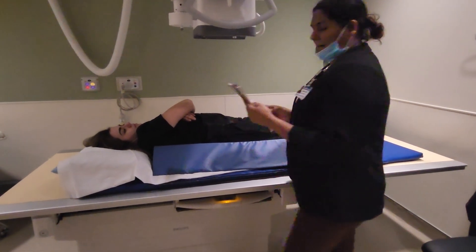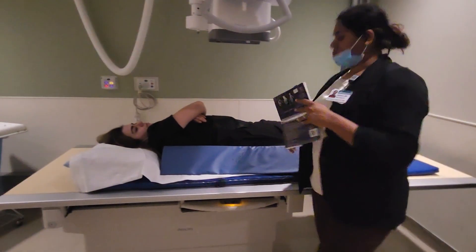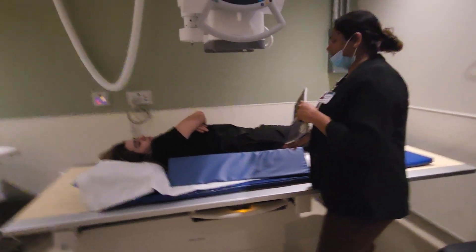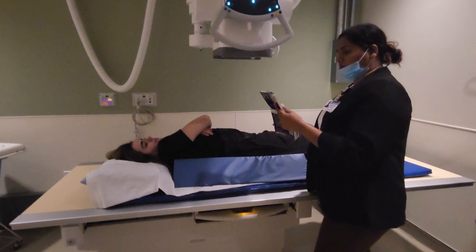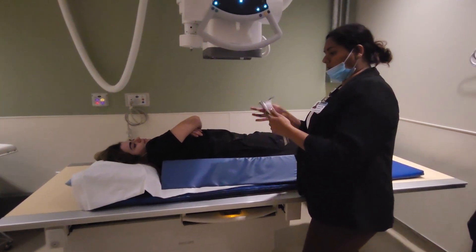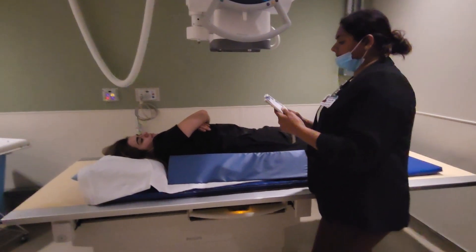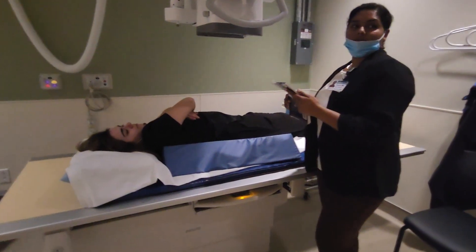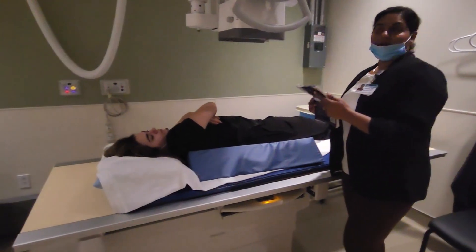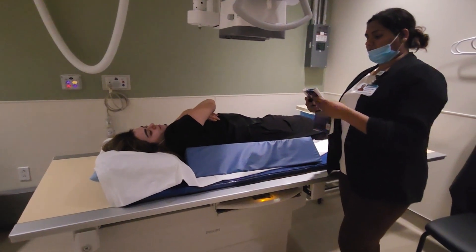She's at a 30-degree oblique. The side up is marked — correct, for the SI joint. For the L1 — correct. And we only do LPO — someone was paying attention.